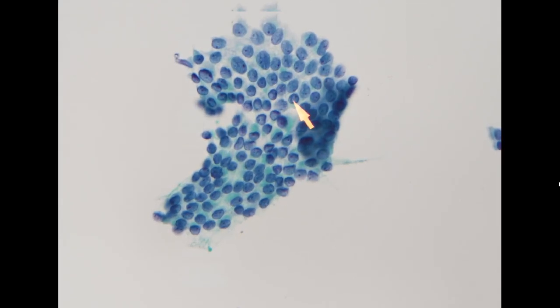And then we start to appreciate there are some vague grooves. Perhaps this looks like a pseudo inclusion, a groove over here, maybe a few grooves over here as well. So the nuclear features do show features of papillary thyroid carcinoma.